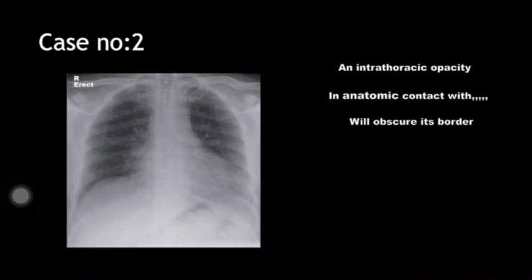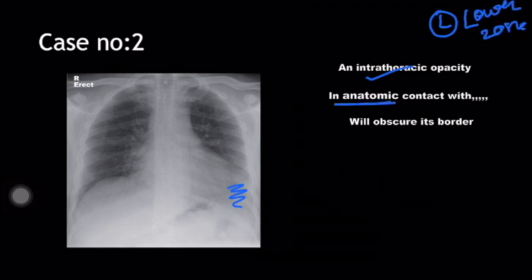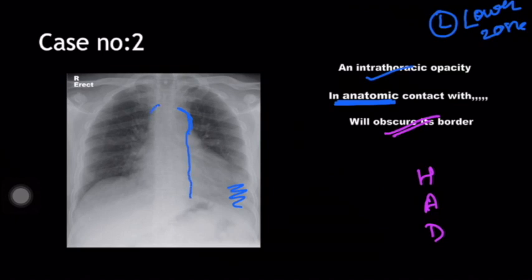Coming to case number 2 — there is an intrathoracic opacity in the left lower zone. To find out the anatomical location, let's look at what it is obscuring: heart, aorta, or diaphragm? Let's take the aorta first. This is the region of the aortic knuckle, this is the descending aortic line, here forms the ascending aorta — so the aorta is intact.